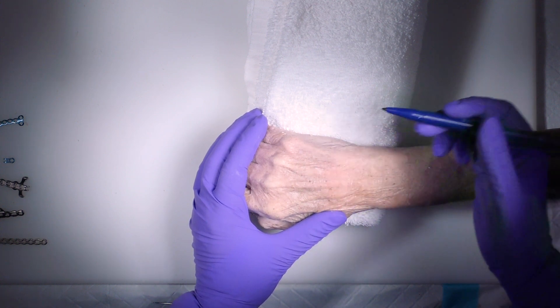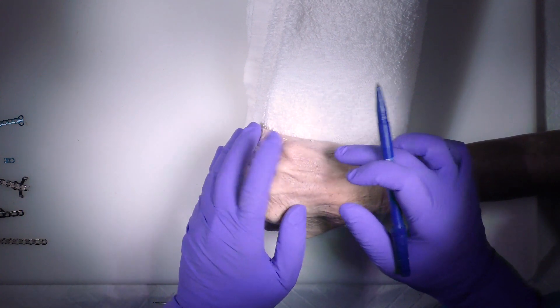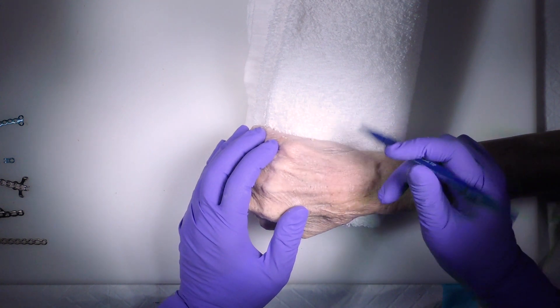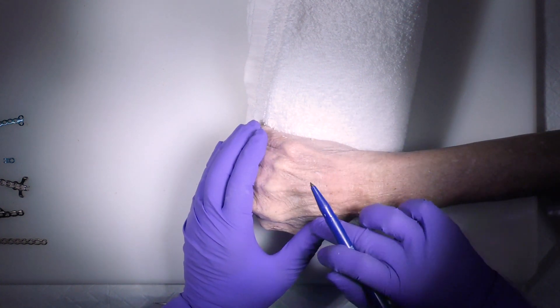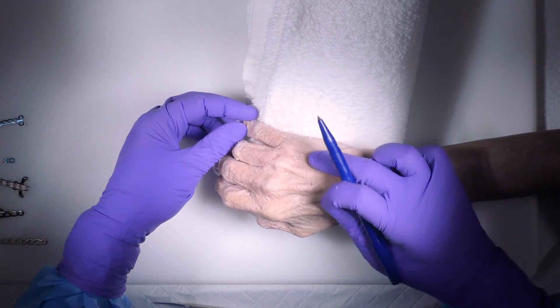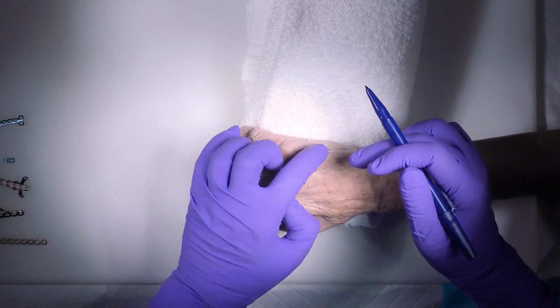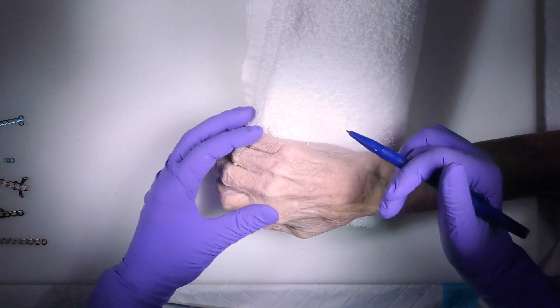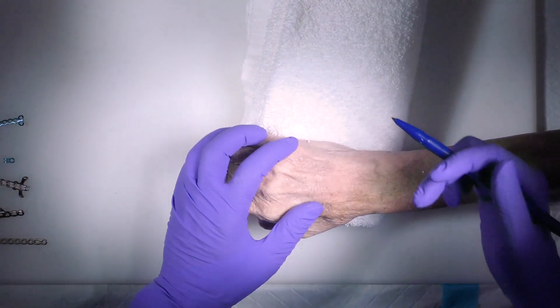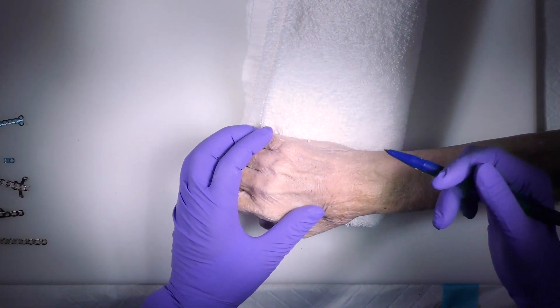If you're doing just a single metacarpal, then obviously you place it where it needs to be. When you're dealing with Boxer's fractures, we tend to place the incision a little bit off axis. We can go straight dorsal if we want, but with all your exposures of the metacarpals, you're always finding the extensor tendons. So when you go off axis with the fifth metacarpal or the small finger metacarpal, you're not fighting the extensor tendon as much. Plus the plate sits a touch lateral or ulnar, if you will. So it kind of facilitates.